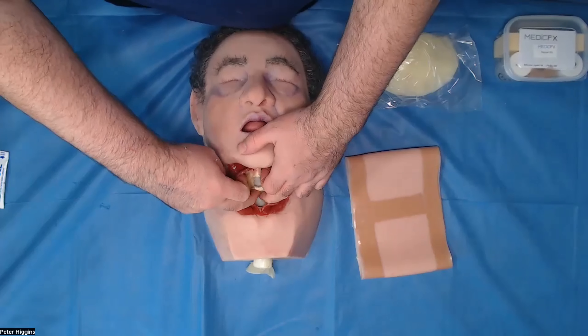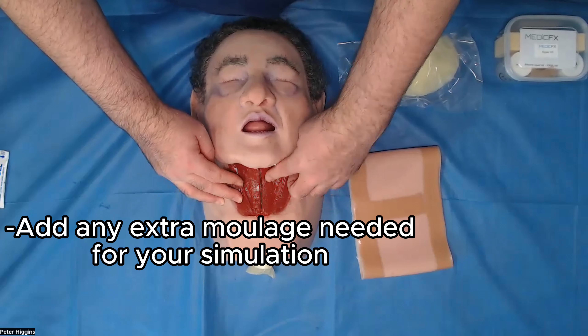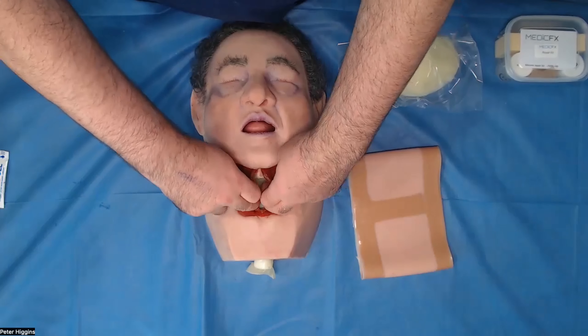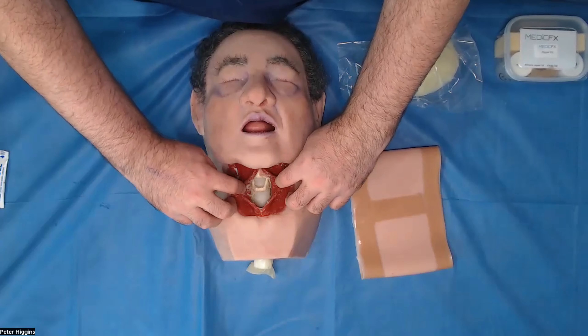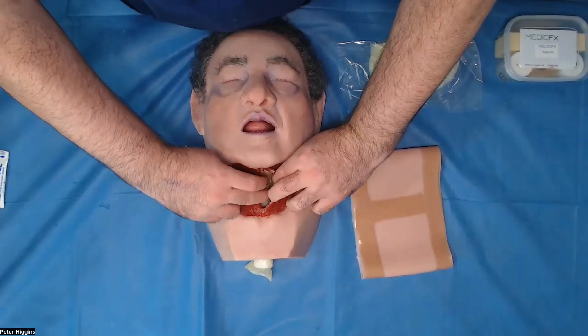Once that's in place, you're very welcome to pop some moulage in here. So maybe a little bit of fake blood or fake blood clot around the trachea and around the strap muscles here, just if you want to add that extra level of immersion for your participants.